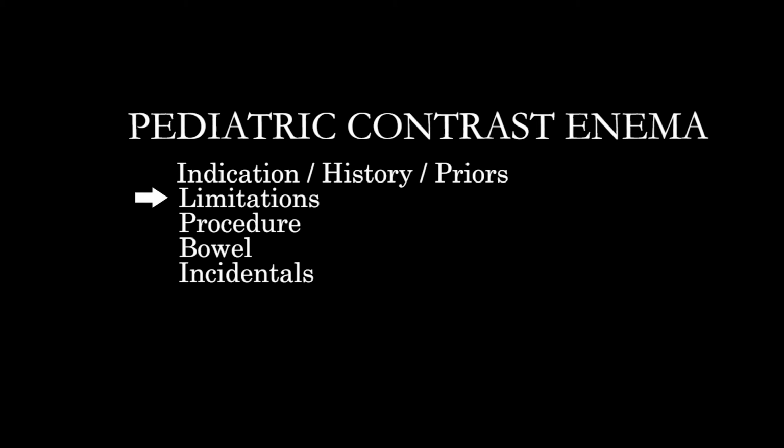And then, when you're actually in the room, you want to examine the patient yourself and look for rectal malformations or anything that's going to impact how you do the exam. And then, if there's a significantly high concern based on the clinical history, based on the presentation of active inflammation or an enterocolitis, you may want to delay the exam, because instilling that contrast or performing this exam can increase the risk of perforation and sepsis.